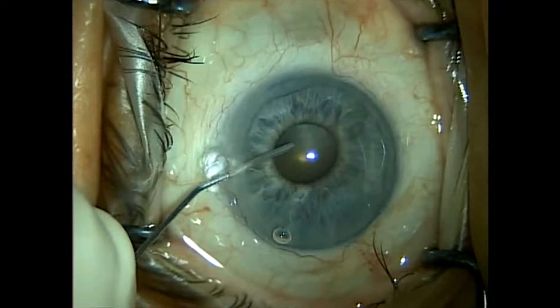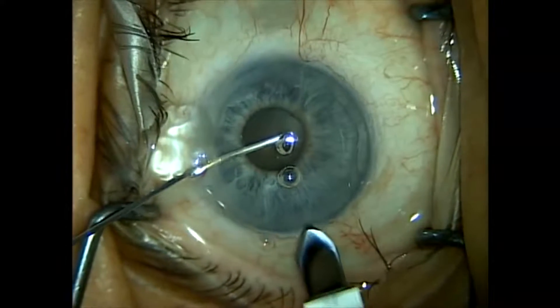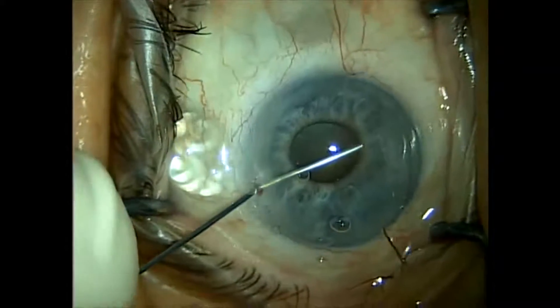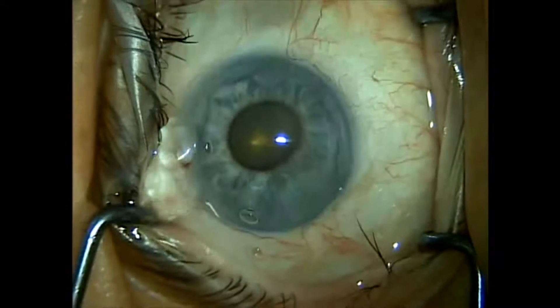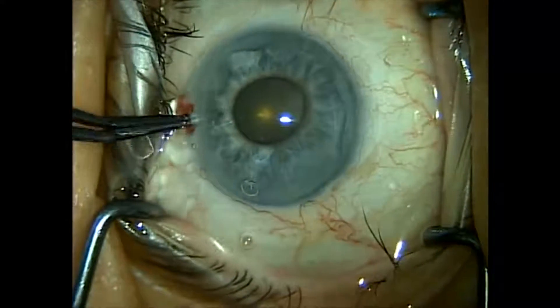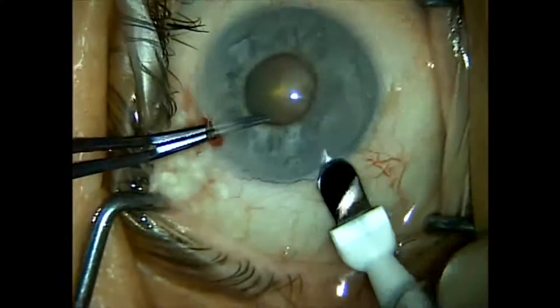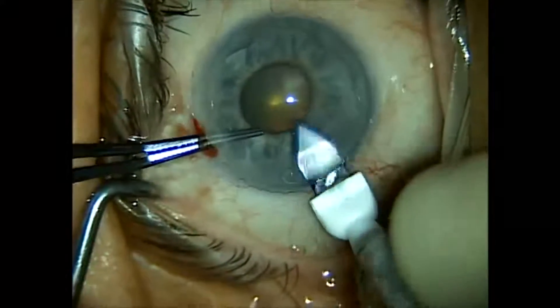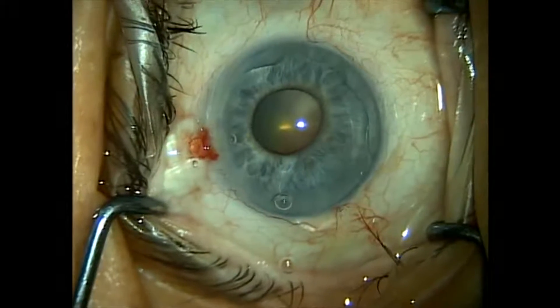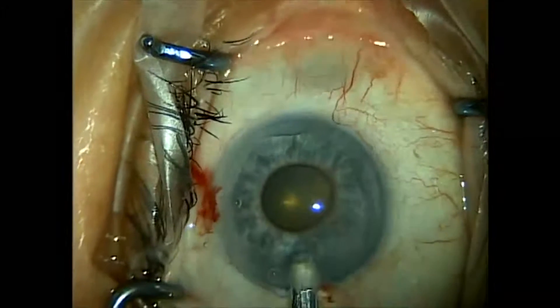We fill the eye with HEALON GV and then we make our usual 2.8 millimeter keratome incision into the anterior chamber. Then we prepare the Malyugin ring — we're using a 6.25 millimeter Malyugin ring, just retracted from its holding case. We insert it beveled down.